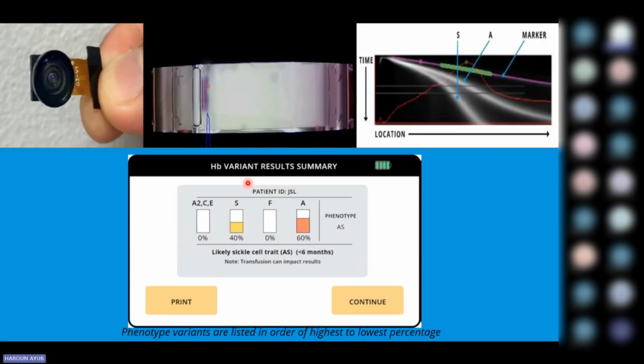How it happens, or the back end of it: there's a high-speed camera inside the analyzer. It's recording the video within that particular 8 minutes. It's actually recording how this movement is happening. Based on the algorithms by the manufacturer, it represents the normal movement of the blood, and if there is any issue with this movement, you'll get errors.